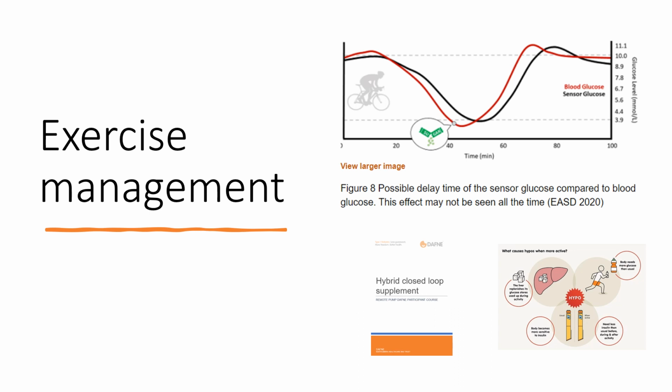Managing exercise using HCL is the topic where guidance differs most from the general guidance for pump users. Make sure you're familiar with the content of the hybrid closed-loop supplement if you'll have hybrid closed-loop users attending your courses.